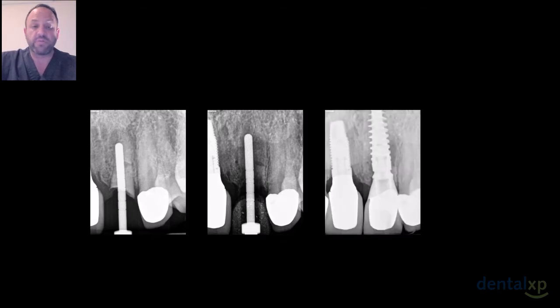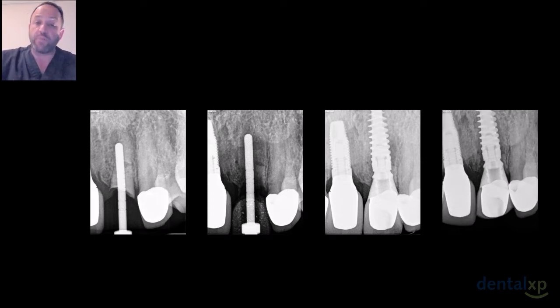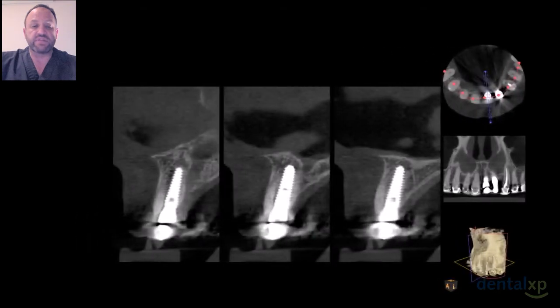And if you look closely, you will see that we've got two implants next to each other. So if you go back to that slide and see how well the papilla is there and how little collapse we've got, the buccal shield is the sole reason we've managed to maintain that. If we didn't have the buccal shield, we would start to lose more dimension on the implant next door as well as where we place the implant. So we get total collapse of that ridge, whereas the buccal shield in this case has held everything together.